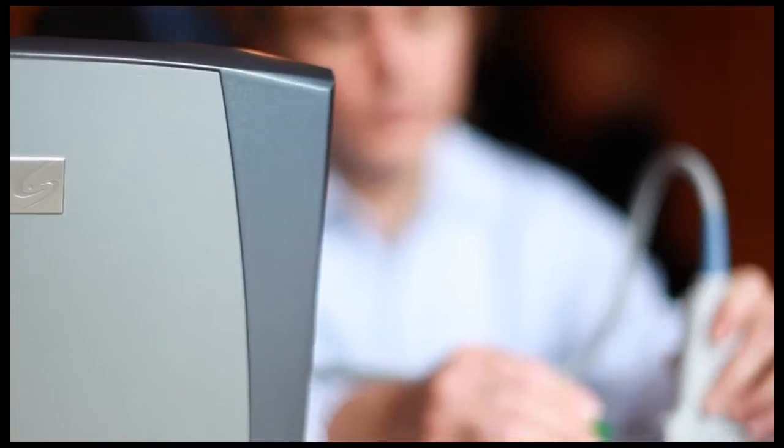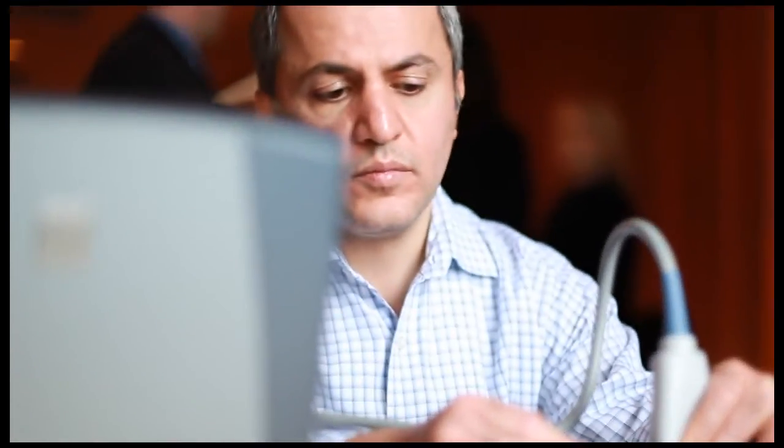Everybody got a chance to use the ultrasound machine for all the different body parts. It's very helpful. It's focused — you get in, you get some stuff done, you get to see some stuff.